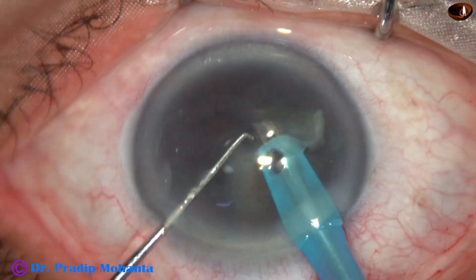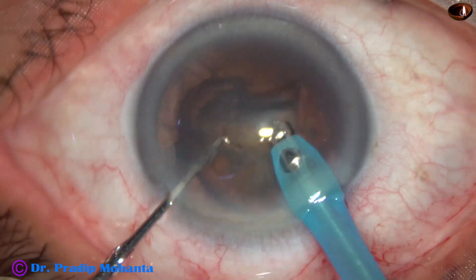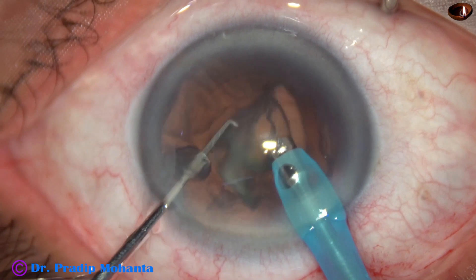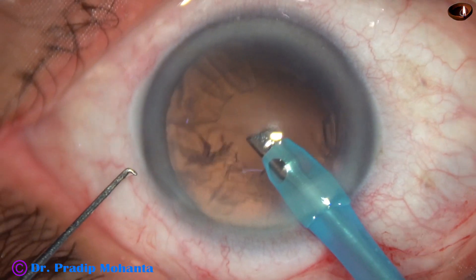This is the third fragment. And this is the last one. During emulsification of the last fragment, we can reduce the parameters for safe FACO.